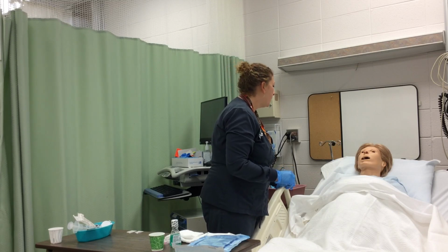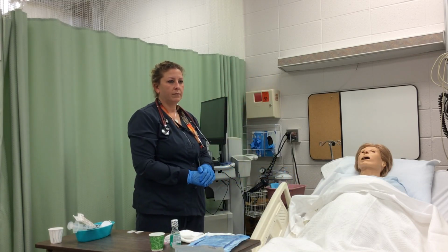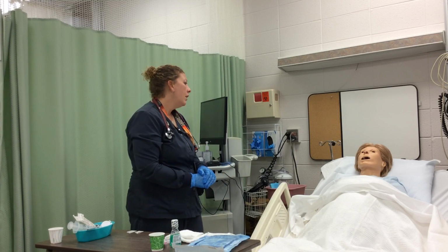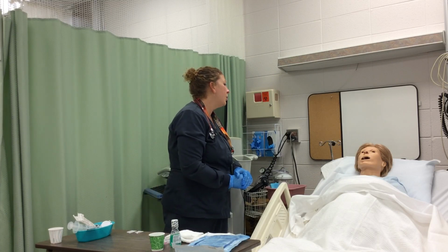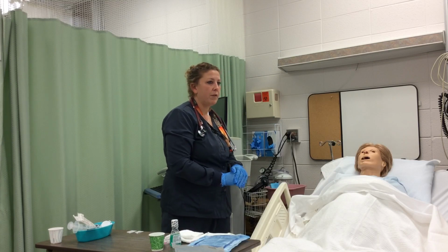Have you ever had any nasal surgeries or problems with your nose? No? Great. Perform a mental status assessment. Do you know where you are? Do you know what year it is? And I've already asked the patient their name and date of birth.